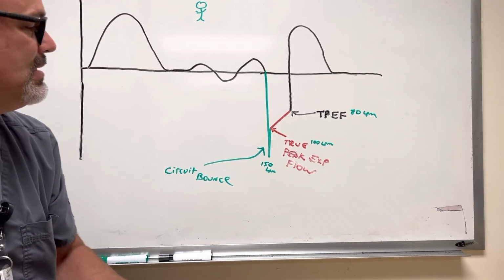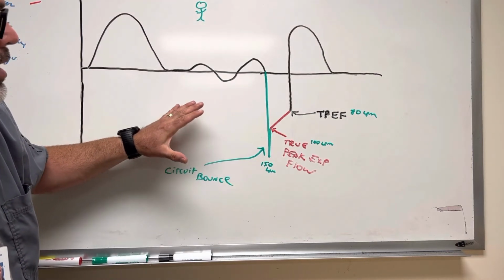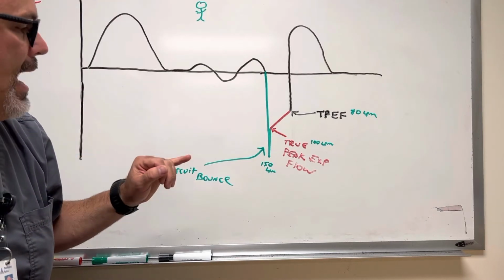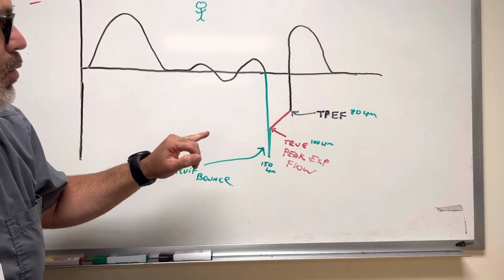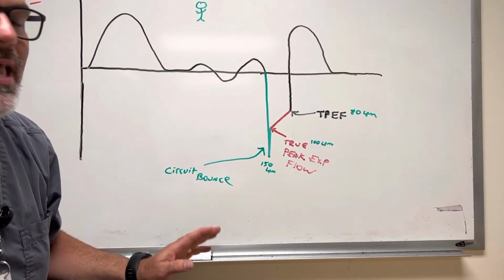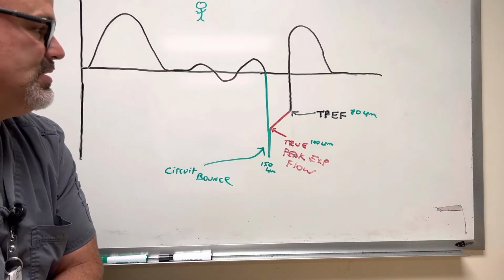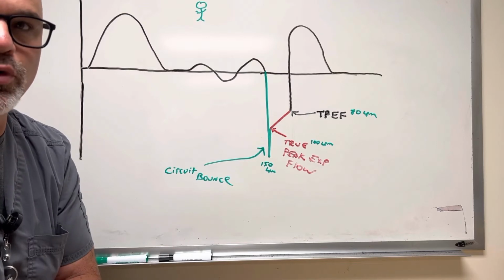And how we're going to look at this information is our waveform is depicted here. And what we're looking for as our actual peak expiratory flow rate in APRV is the flow to actually start to decelerate. And at that point where the flow starts to decelerate, Dr. Habashi thinks that that is where the true patient's lung flow becomes realized.